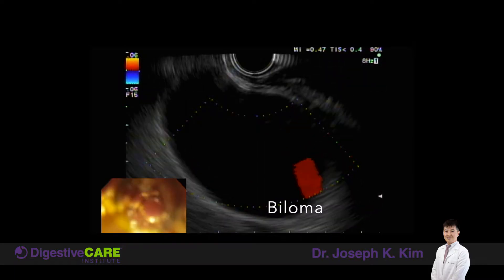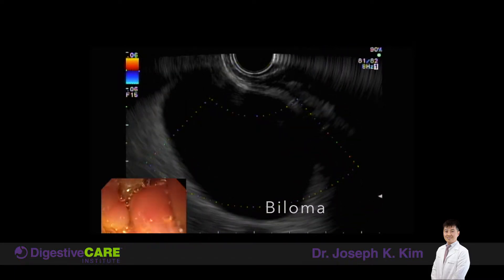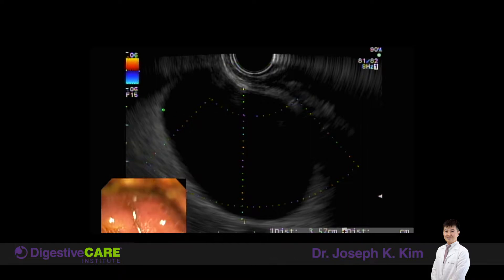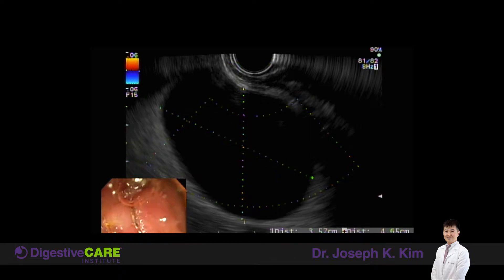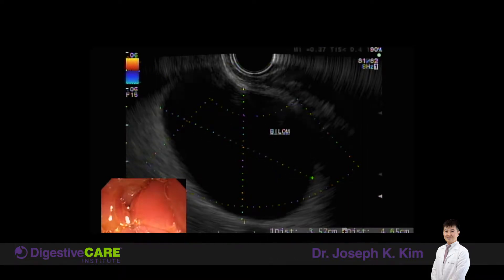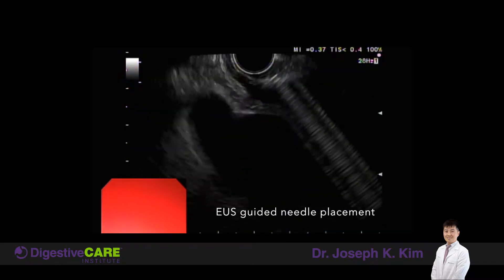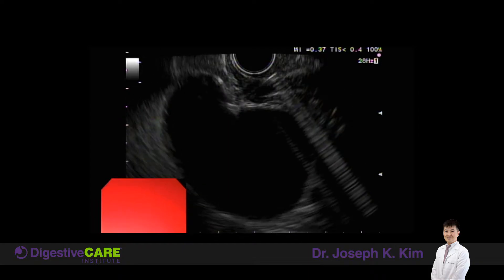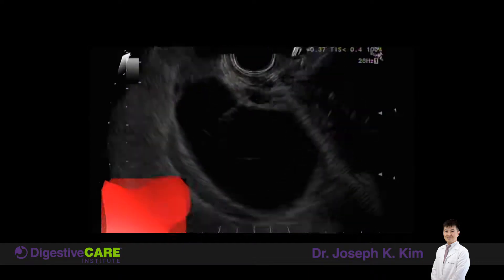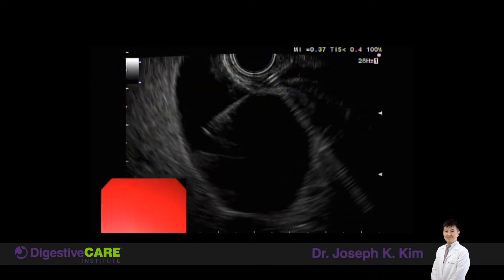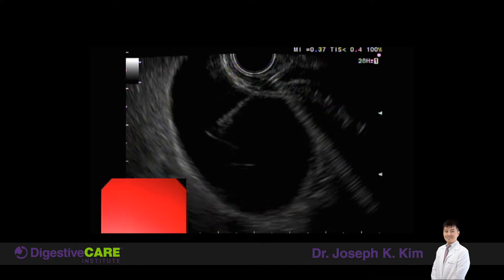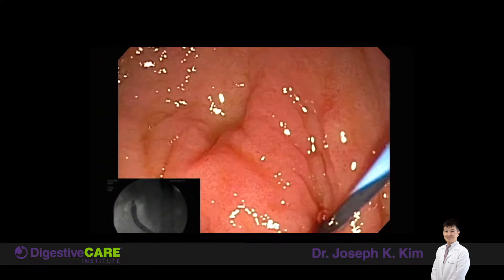Now starting the video — this is the biloma drainage video. This part shows the measurements for the biloma, which is the fluid collection of bile. This is endoscopic ultrasound; I'm using endoscopic ultrasound to identify this collection. Then at the top you see the needle poking through it, through the stomach wall, into the biloma, and that bright white light is visible there.